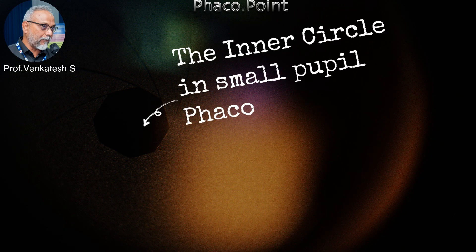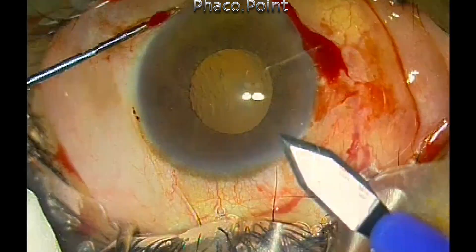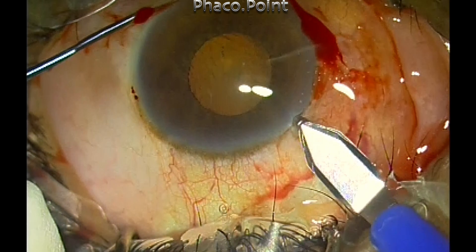Hello, my dear friends. In this video I would like to emphasize that as long as you remain within the central inner circle that lies within the pupillary area, you can safely perform phacoemulsification even in very, very small pupils without needing pupil dilating devices.